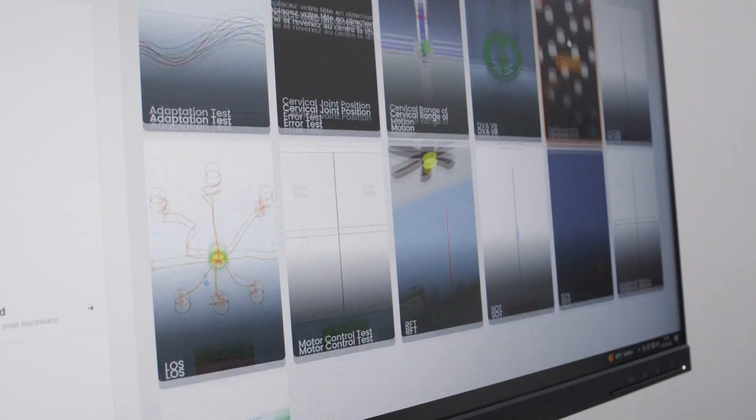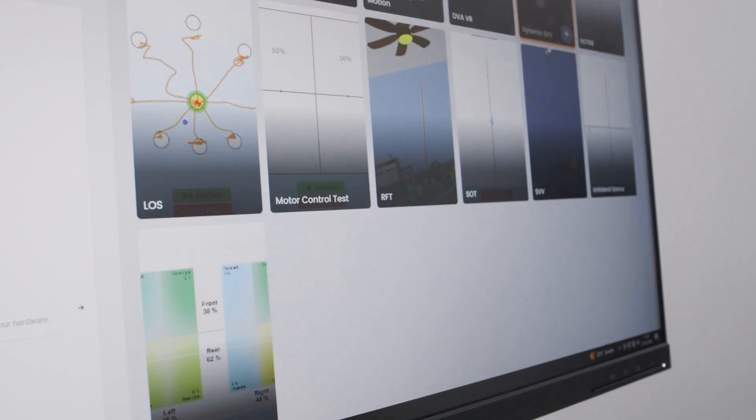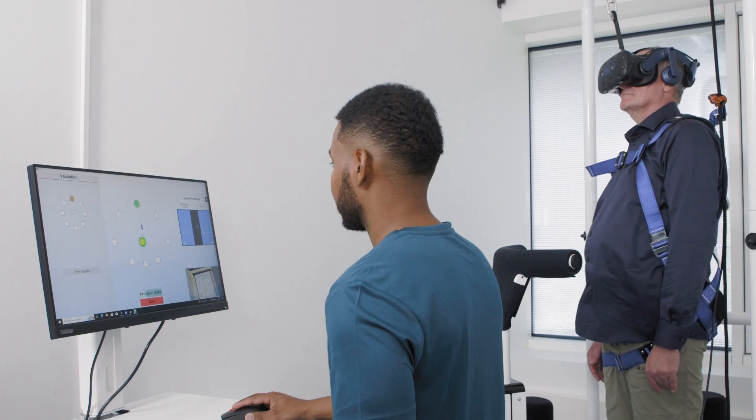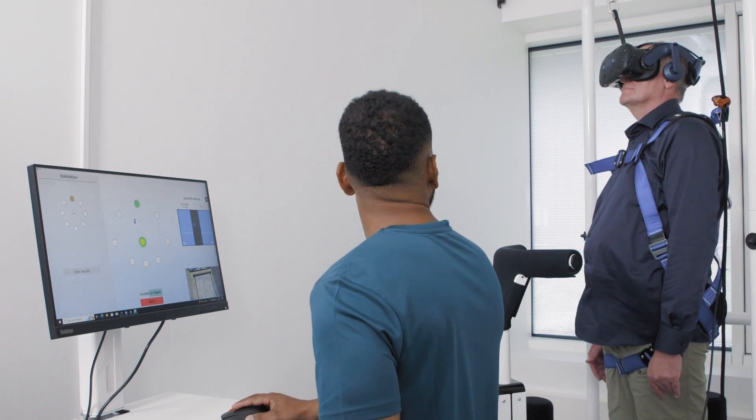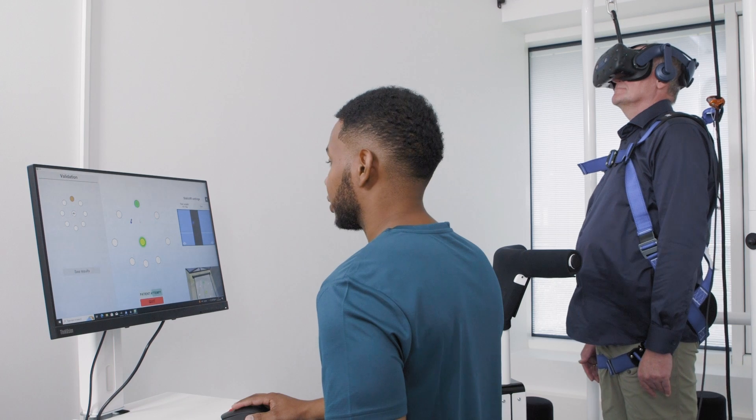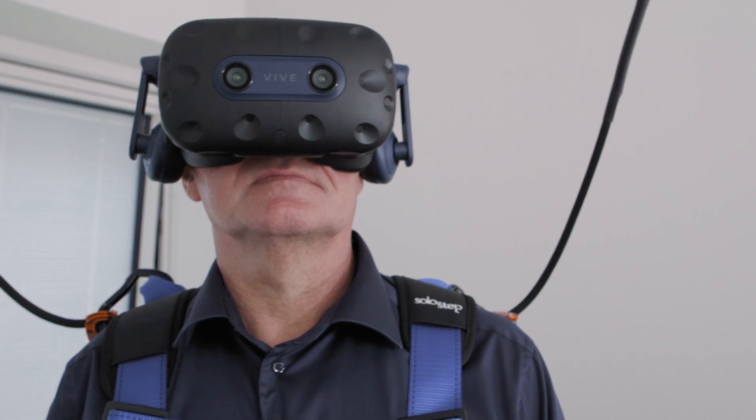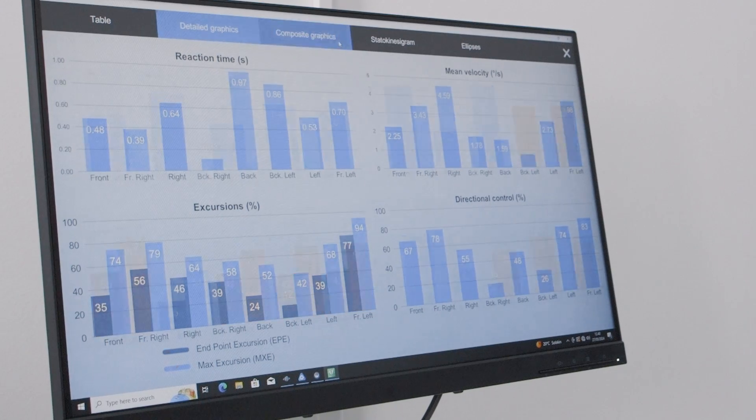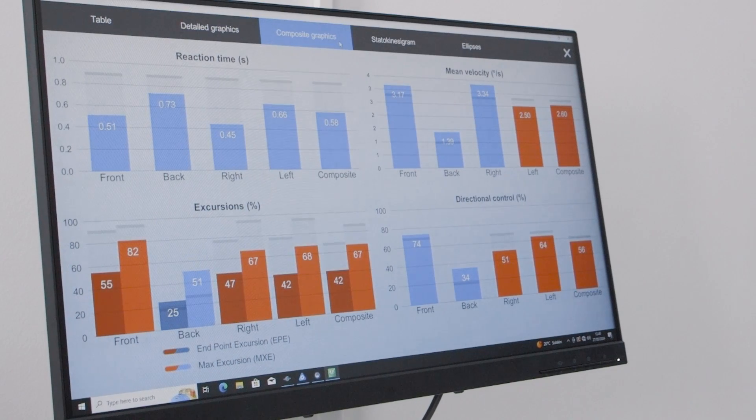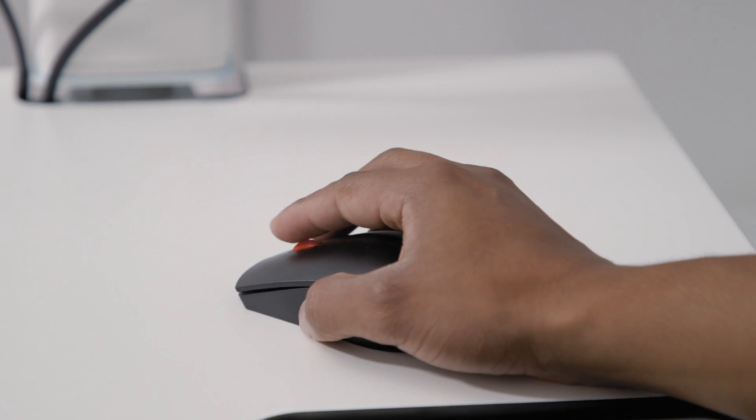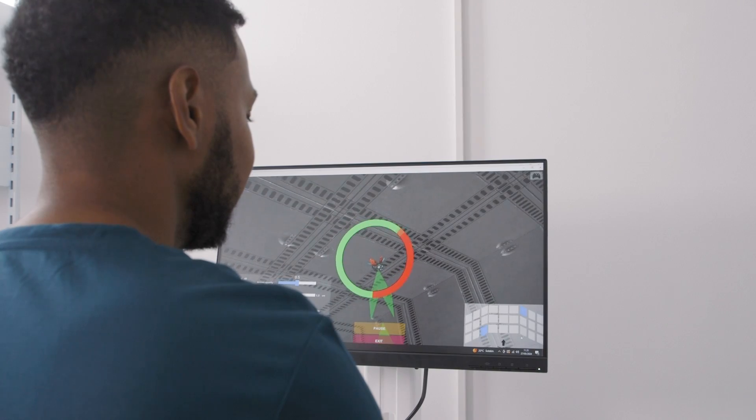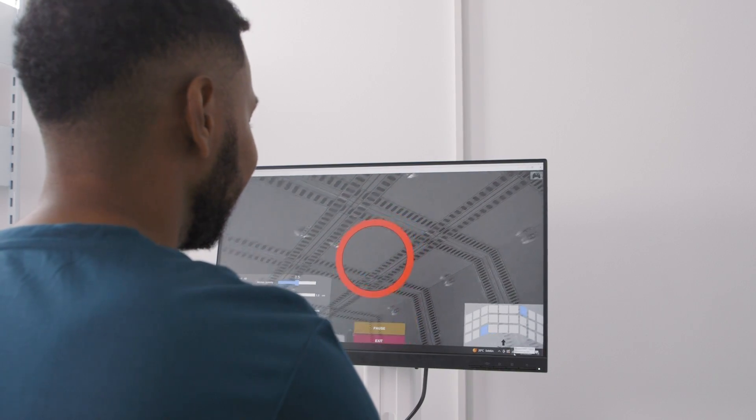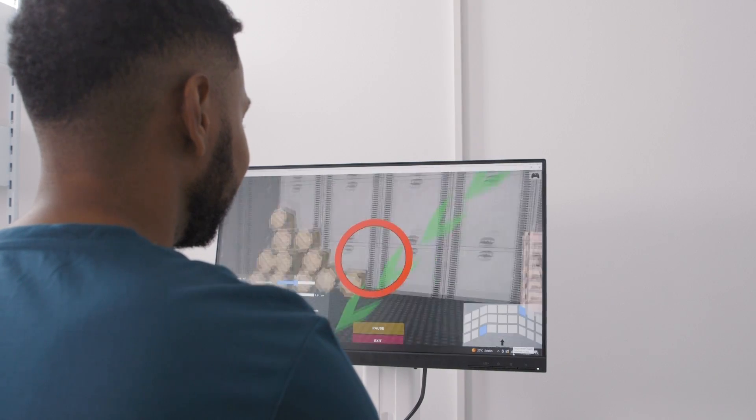You can perform a variety of assessments such as the limits of stability test and the sensory organization test. The assessments provide you with the data you need to create a personalized rehabilitation program for your patient.